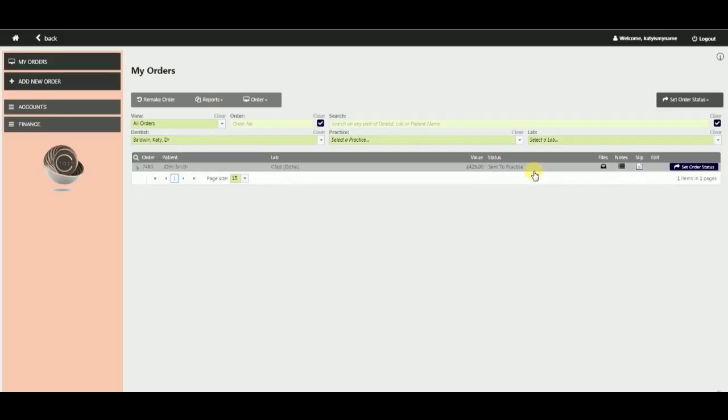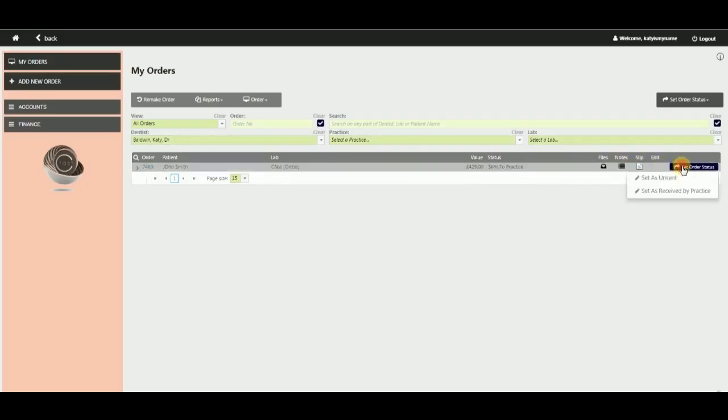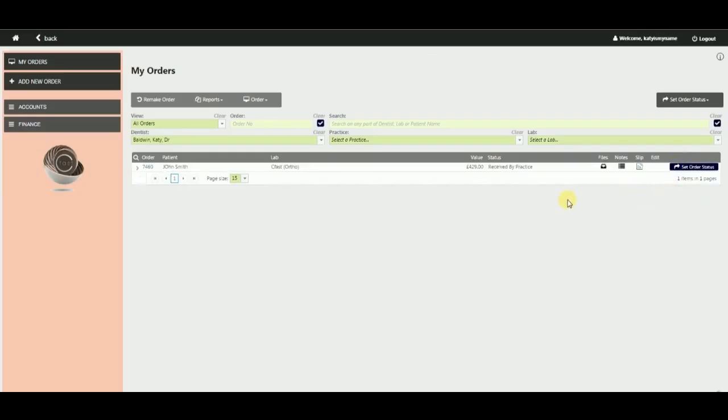When the lab work is delivered, you should log in and set the status to received by practice. You can then see the patient and fit the appliance.